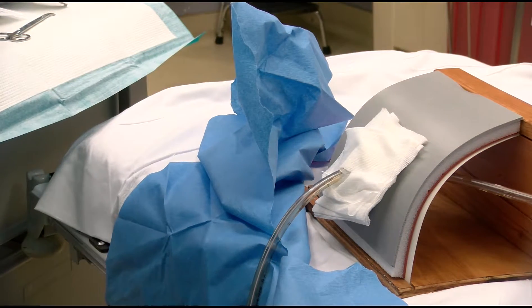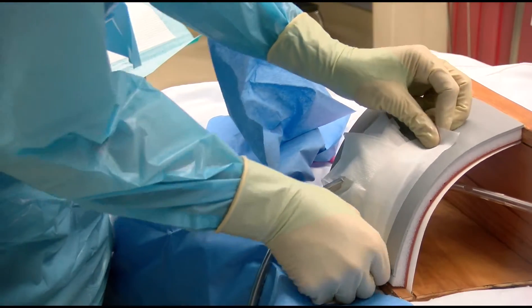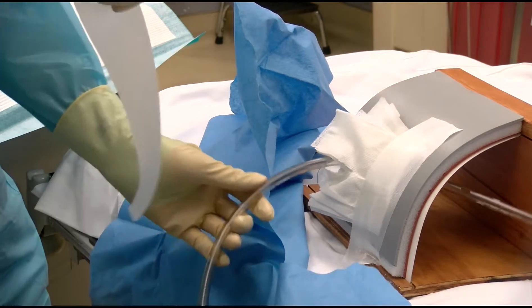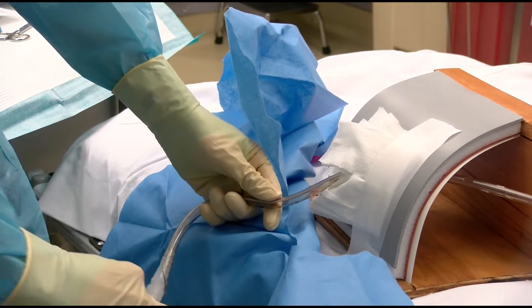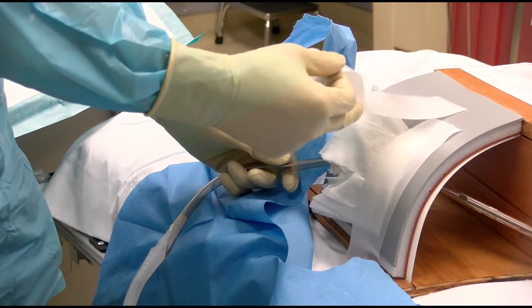The gauze can now be secured to the skin using the tape sections that were torn off and made available at the beginning of the setup. As a courtesy to the patient, cover the nipple with a small section of gauze prior to placing the tape to minimize discomfort during removal later.